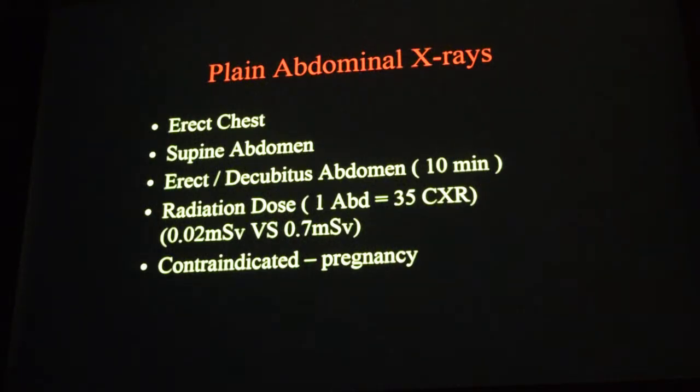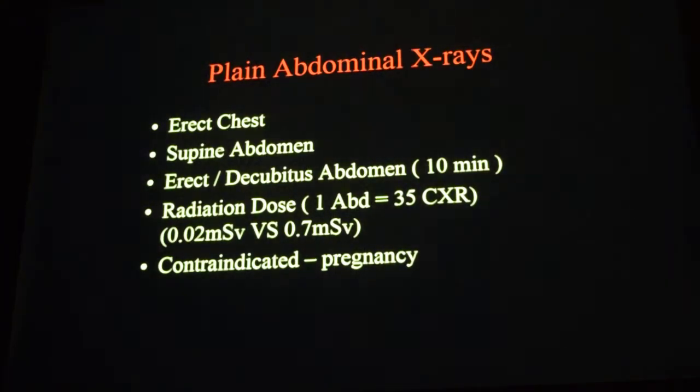You know, there are these penetrating factors that we use like kV and mAs. Have you heard of this in your physics class? Probably not. Okay, so these are the factors. The X-rays have energy in them, so we decide what sort of energy these X-rays should have when they penetrate the body.